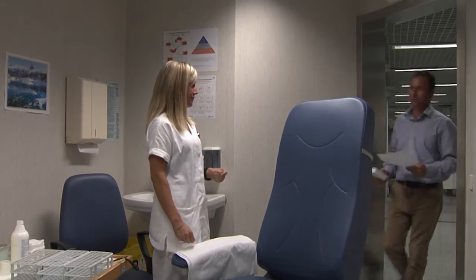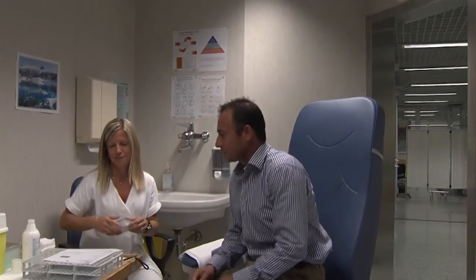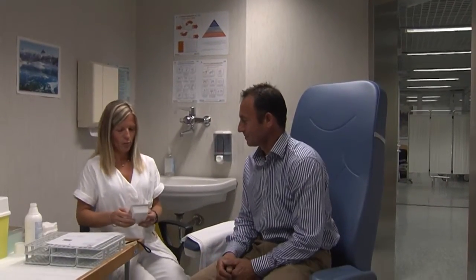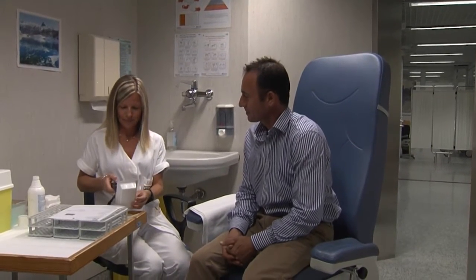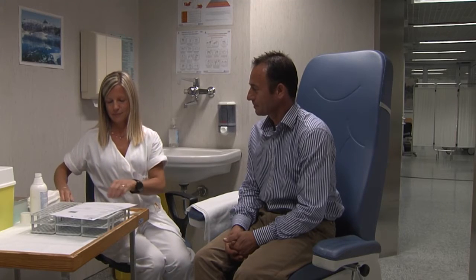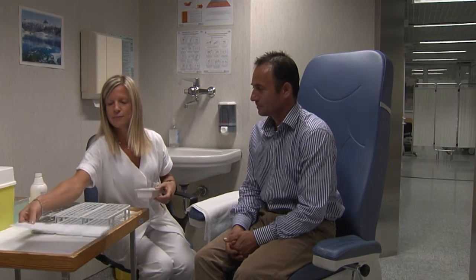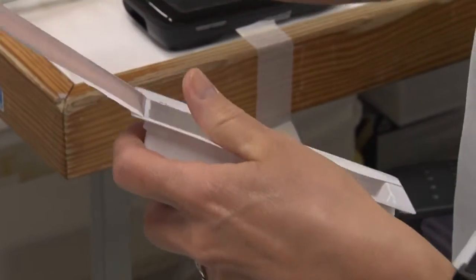The patient waits his turn with his own patient kit with him, closed and sealed. Once the patient has entered the sampling cubicle, the operator carries out the identification of the patient, both verbally and through a handheld computer that checks that the patient kit combination is correct. At the same time, the handheld device registers the identity of the operator who is carrying out the sampling. At the end of the process, the data is uploaded to the server for storage.